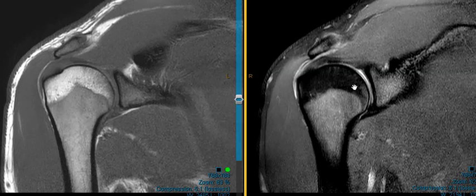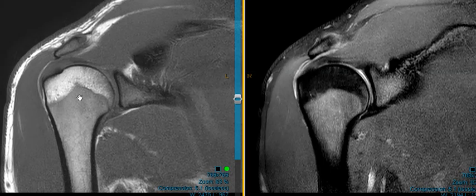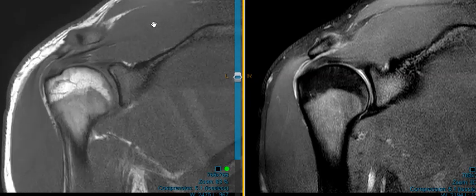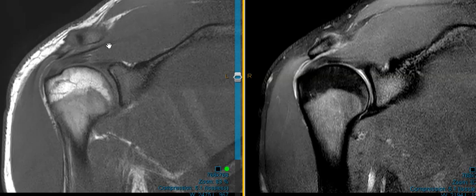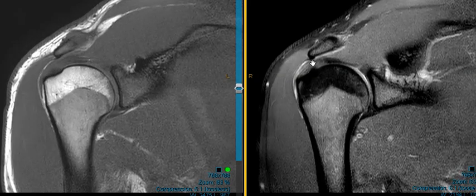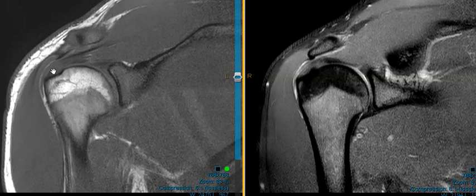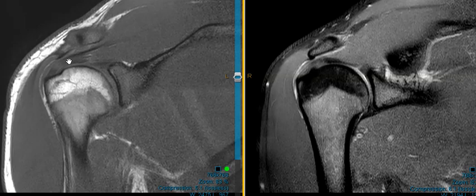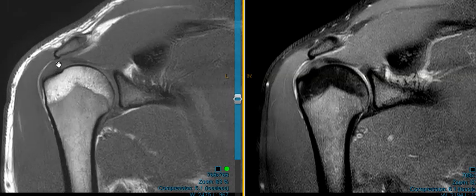This is a very common finding to cause shoulder pain. In this patient we have the round humeral head, we have the glenoid part of the scapula — the shoulder joint — and up here we have the supraspinatus muscle, the rotator cuff component that is up high. That muscle turns into a tendon and the tendon attaches over here on the humeral head. The tendon should be really dark, but instead it is gray, so they have what we call tendinopathy or tendinitis — just irritation and microscopic injury.